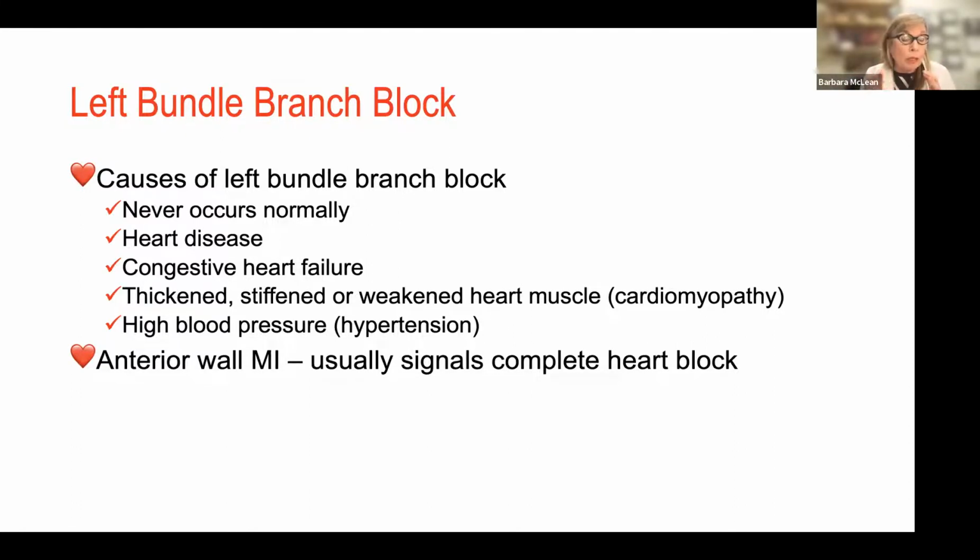Okay, so this is really important. It also can be one of the earliest signs of an acute anterior myocardial infarction. So just remember that LAD, the left anterior descending coronary artery, the most common vessel that is occluded, actually supplies that common bundle of His. That common bundle of His before the bifurcation to anterior and posterior. And you can lose your left bundle. And what's really important to remember is if I have a high grade left anterior descending coronary artery occlusion, I may first see my patient with the first degree AV block and a left bundle branch block.